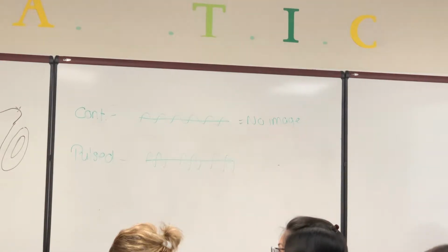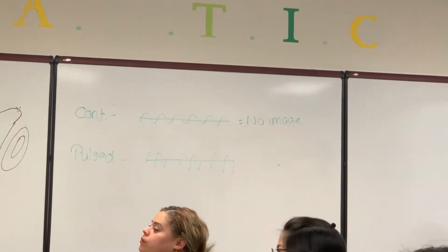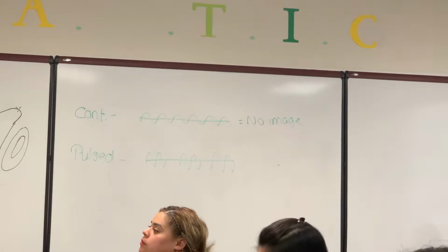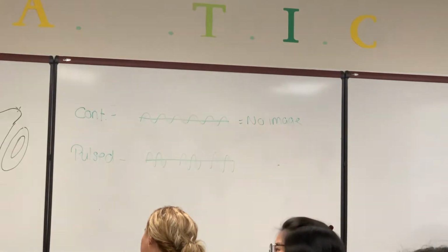Mind you, guys, this is happening so fast, in less than 1 microsecond. That's why you have that constant motion on your image, even though it's really not, because it's listening for the sound as well. It happens faster than the eye can catch, so it appears to be in motion, but it's really not.